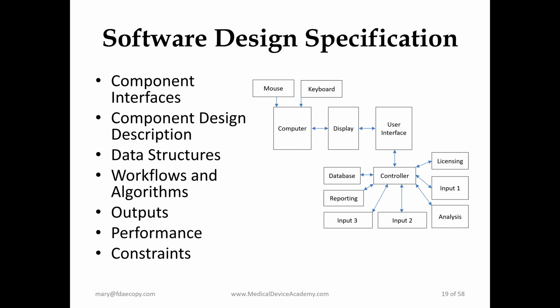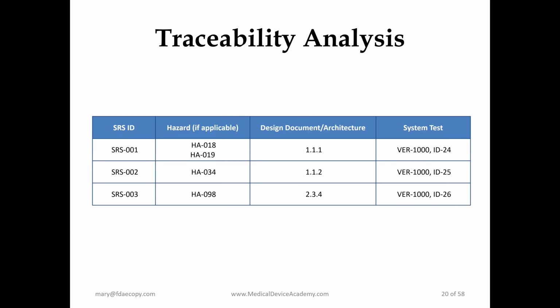A lot of times you'll see the software design specification identify each of these bullets for each of the different units. That's a good structure to paint the whole picture and give the full story of the software, so that's what we usually recommend for this one. Next slide.